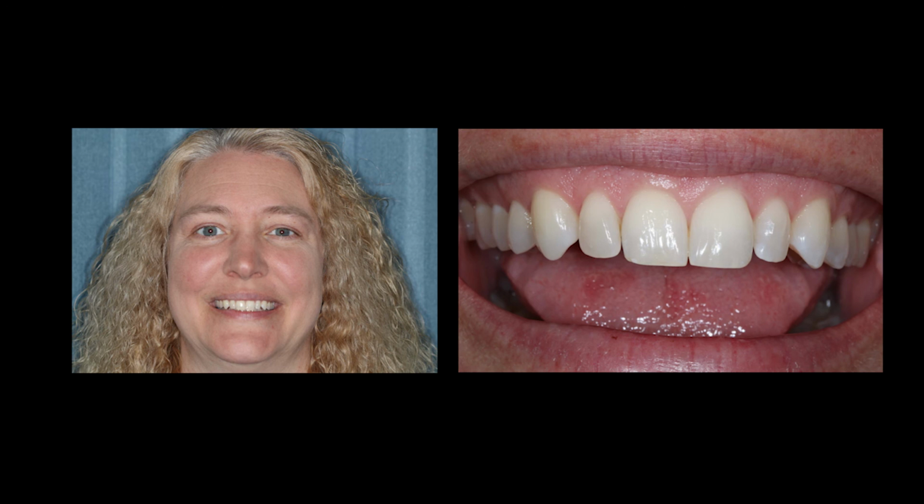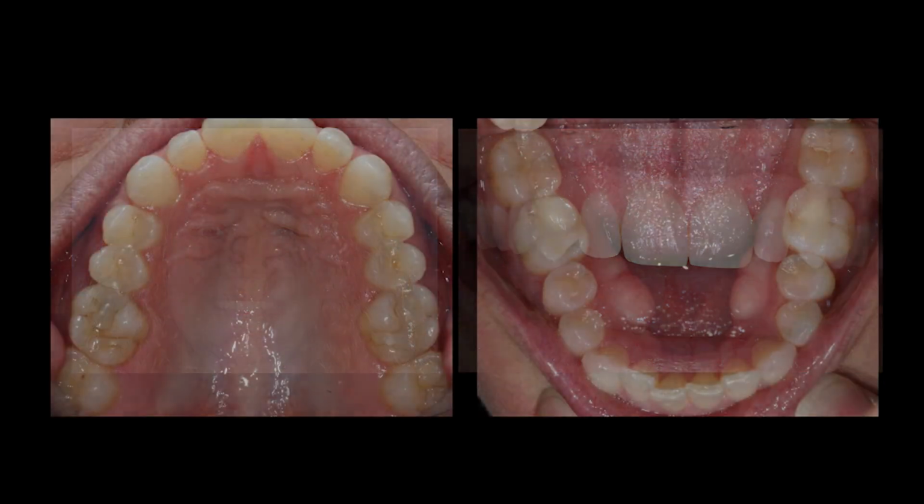That really helps them. It helps you position yourself in showing them options for them, or maybe rebuilding or restoring cases. So some of the photos we see here again are the full face photos, that full smile photo that we talked about, good documentation, good occlusal views.